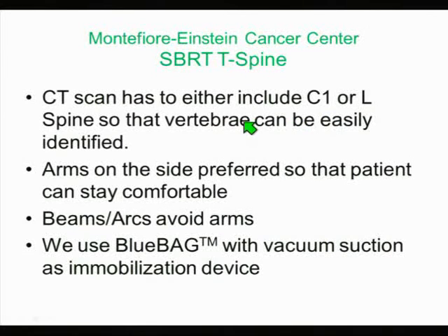so that it's very easy to identify which vertebra you're talking about. Because lots of these patients sometimes have multiple lesions in different vertebrae, and you are only treating one, something that the physician thinks is problematic for the patient's pain or something. So you have to really make sure you are at the right vertebra.